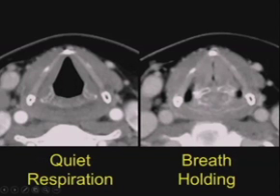If we do a quiet respiration or breath holding with your mouth open, then the cords will go to midline, and we can see if the cords are moving or not. So this is a second pass we may do through that area. If we do that puffy cheek, all the air-filled spaces that we talk about in the throat are going to dilate, so we can do a thin stack through there.